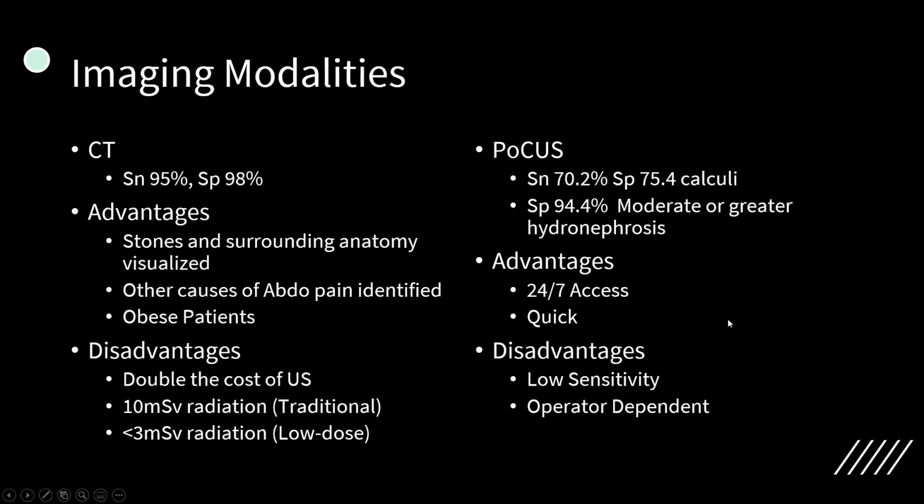The advantages for us, obviously, it's something we have at our fingertips. We can use it 24/7. We don't have to hold the patient overnight for CT or anything like that. It's relatively quick to perform. I think everyone's pretty comfortable doing a renal exam from being a part of our FAST exam. We can get a decent look, and although we might not be able to see stones, and there's probably some operator dependence on the quality, I think most people will be able to pick up really bad, moderate or greater hydro. And I think that's the key point.